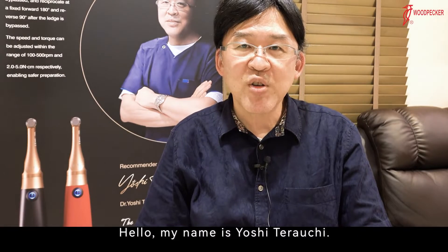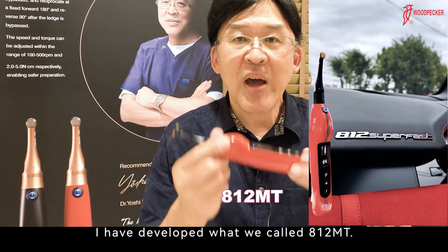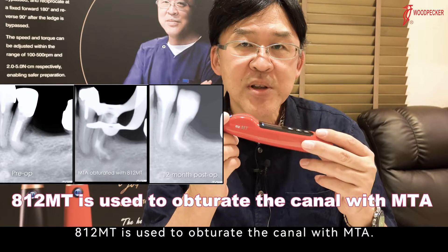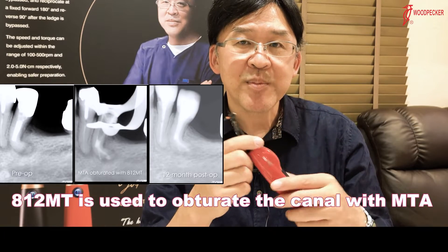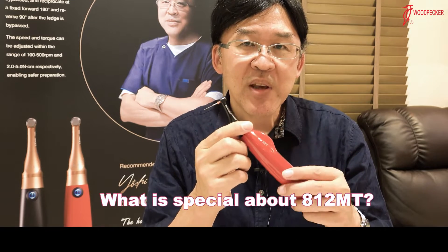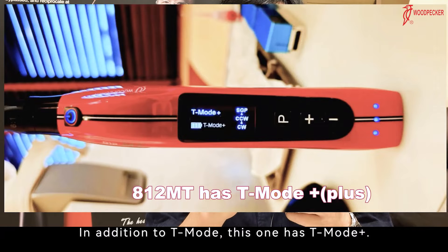Hello, my name is Yoshi Terawuchi. I have developed what we call 812MT. 812MT is used to obturate the canal with MTA. What is special about 812MT? In addition to T-Mode, this one has T-Mode Plus.